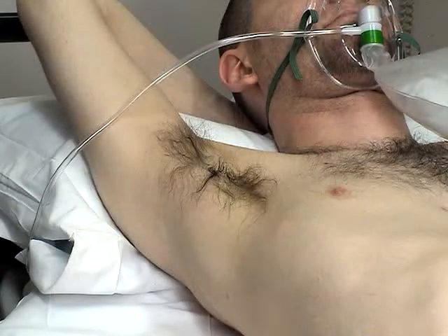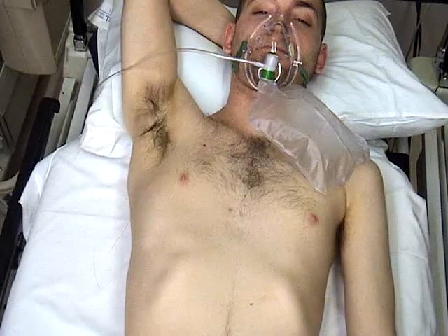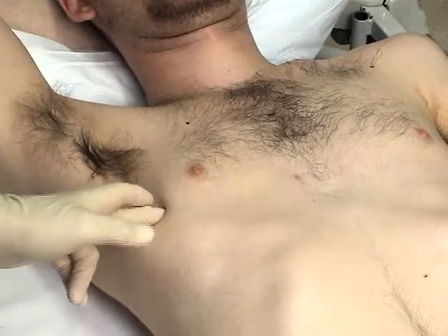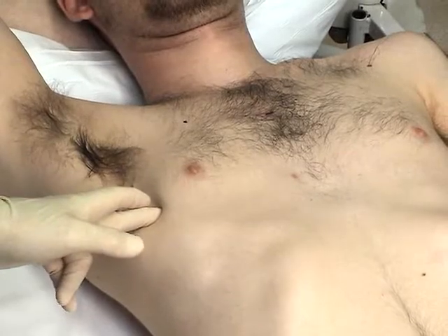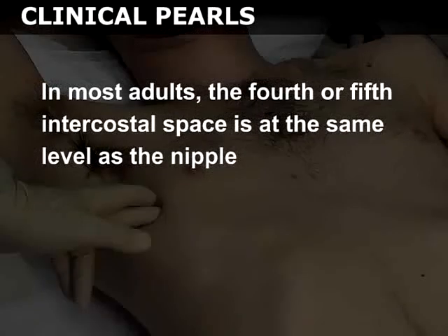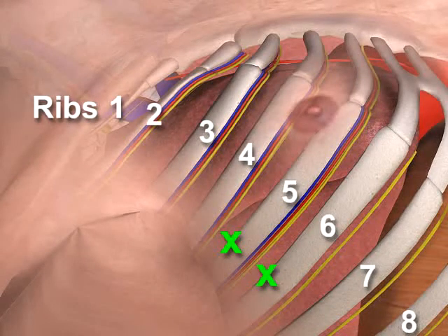Preparation is identical for the mid-axillary approach. The ipsilateral arm may be placed above the patient's head to grant access to the region. Needle entry occurs in the fourth or fifth intercostal space in the mid-axillary line. Try to directly palpate and count the ribs beginning in the axillary fossa. In most adults, the fourth or fifth intercostal space is at the same level as the nipple. Needle insertion occurs over the superior surface of the fifth or sixth rib.